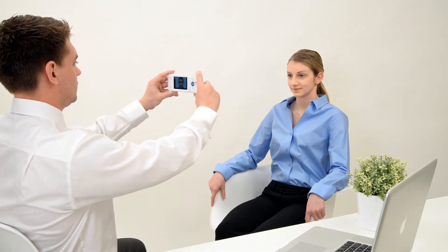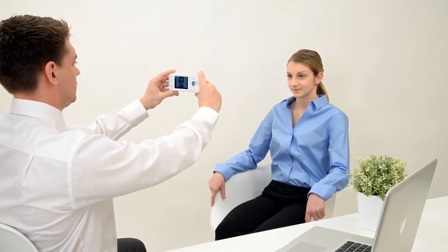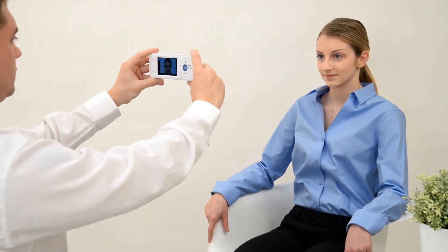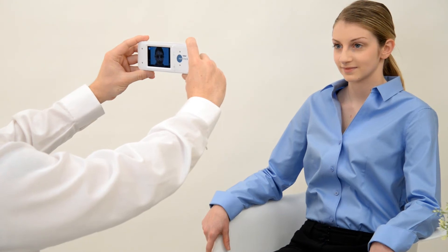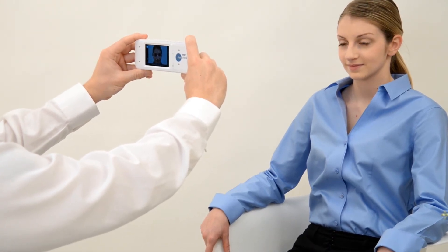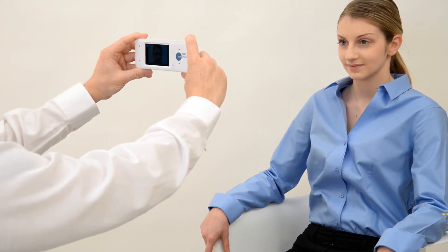The practitioner is required to be on eye level with the subject. To avoid shaking, which could negatively affect measurement accuracy, hold the device with two hands. Using the index finger of the left hand, activate the fixation target button. Keep this pressed down to maintain fixation target activation.